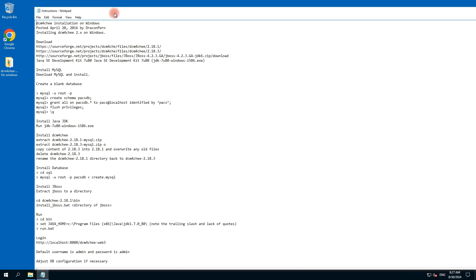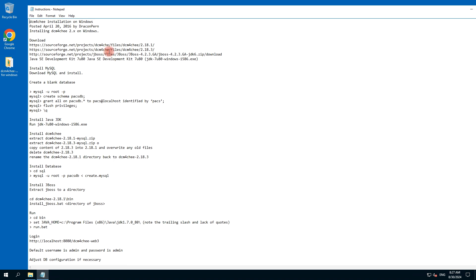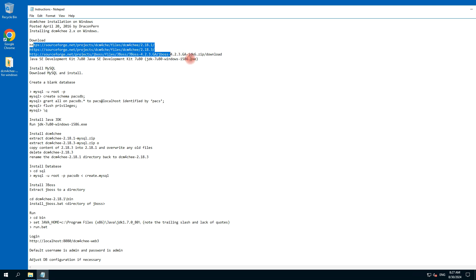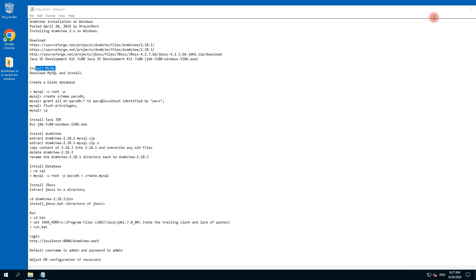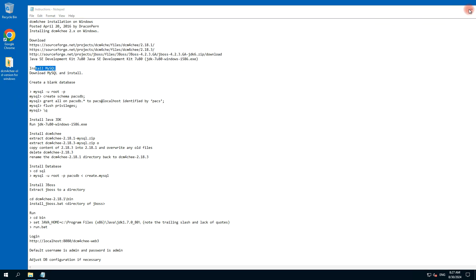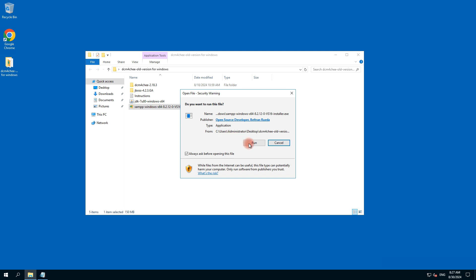First of all you need to download these projects — but I have already compressed these projects. So let's start with installing MySQL. To install MySQL independently, it's better to install the XAMPP server, so let's start the XAMPP server.